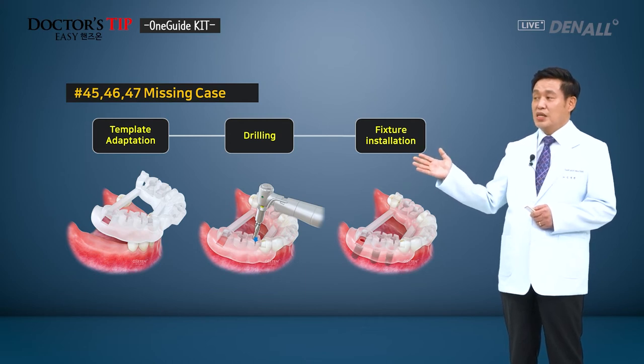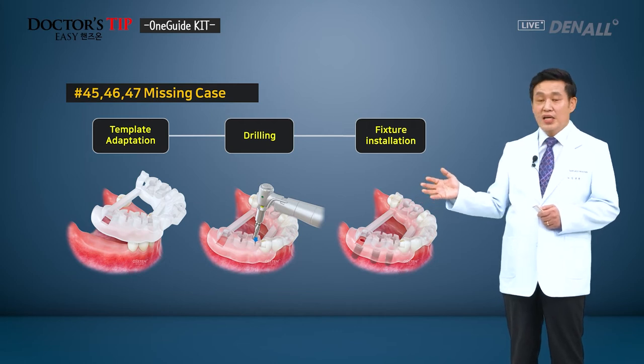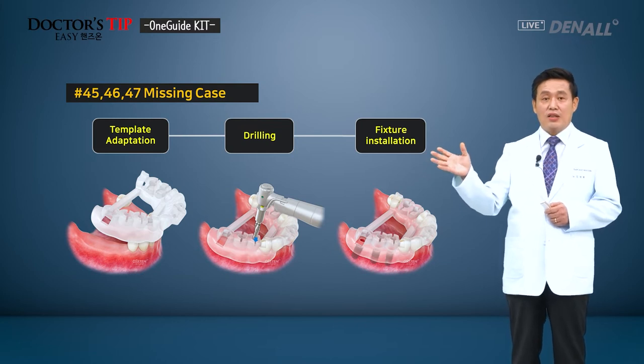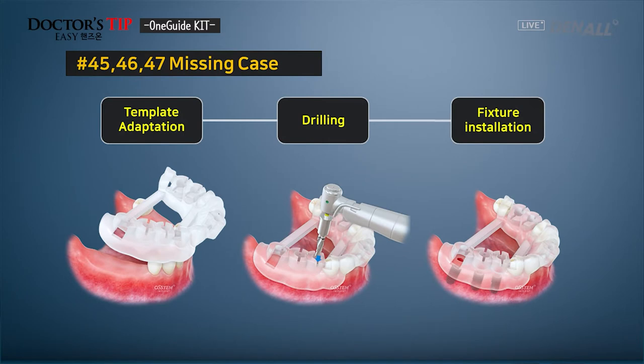So the first is a number 45, 46, 47 missing case. As shown on the front, there are residual teeth, making it tooth bearing. We're going to do template adaptation and check whether it's not moving. And we're going to drill and place the fixture. Hands-on will begin briefly.